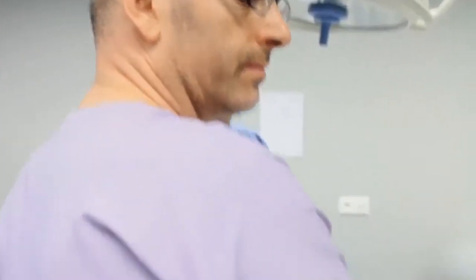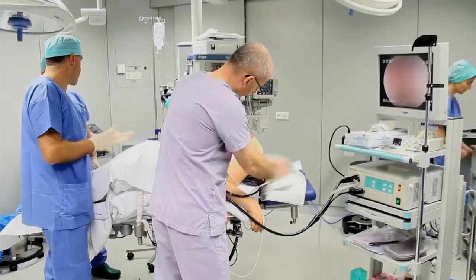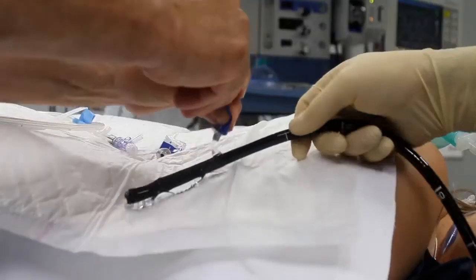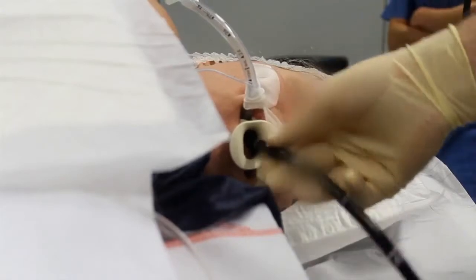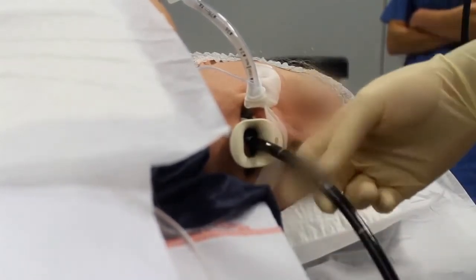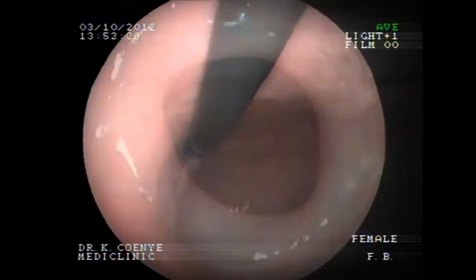For this procedure, general anesthesia is recommended to intubate the patient. The patient must be in a left lateral decubitus position. The first step is to carry out an oesophago-gastro-duodenal fibroscopy in order to rule out the presence of duodenal, gastric, or esophageal lesions, which are contraindications to the placement of the intragastric balloon.